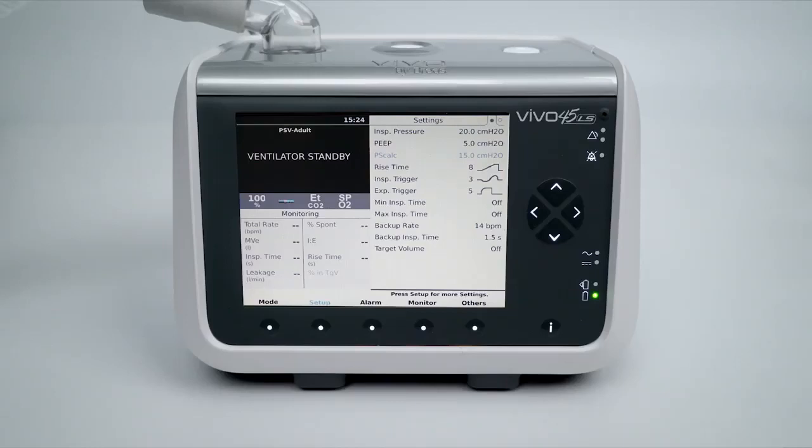These two settings simply tell the ventilator you want to deliver an inspiratory breath that will last at least the minimum amount of time and will not exceed the maximum amount of time. The patient can cycle into exhalation at any point between these two values.